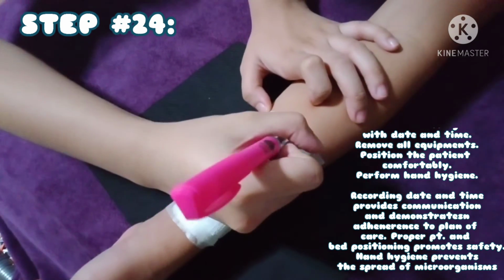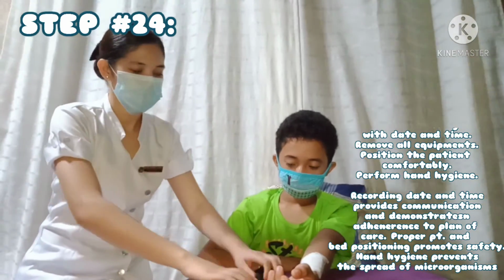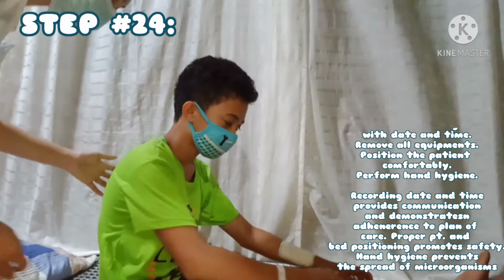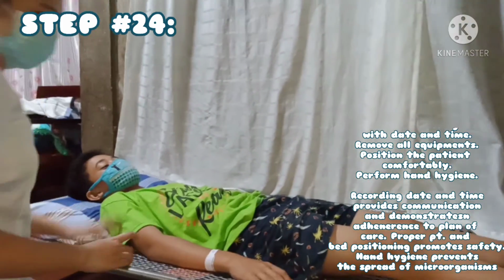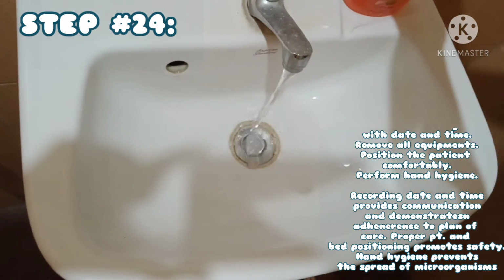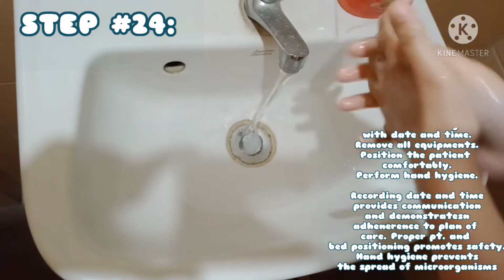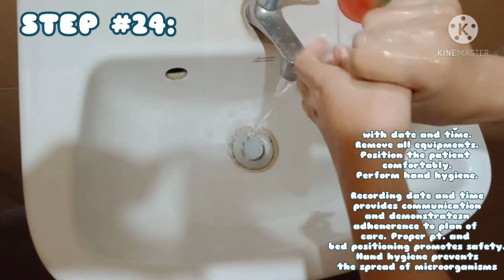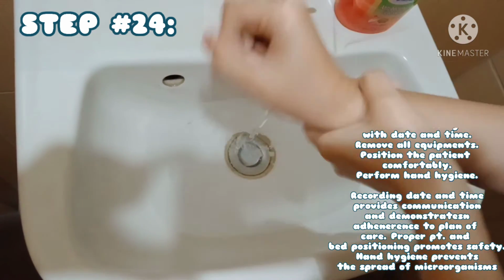Step number 24. After securing the dressing, label the dressing with date and time. Remove all remaining equipment. Place the patient in a comfortable position with side rails up and bed in the lowest position. Perform hand hygiene. Recording date and time provides communication and demonstrates adherence to the plan of care. Proper patient and bed positioning promotes safety. Hand hygiene prevents the spread of microorganisms.